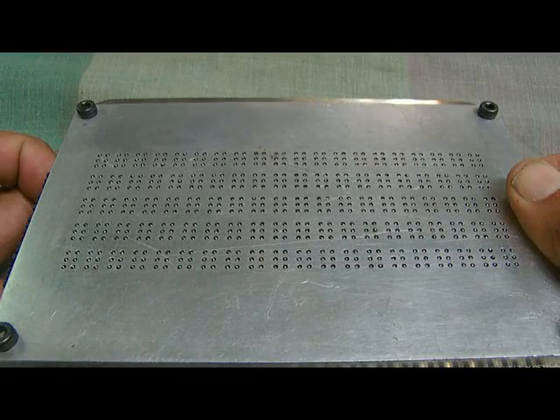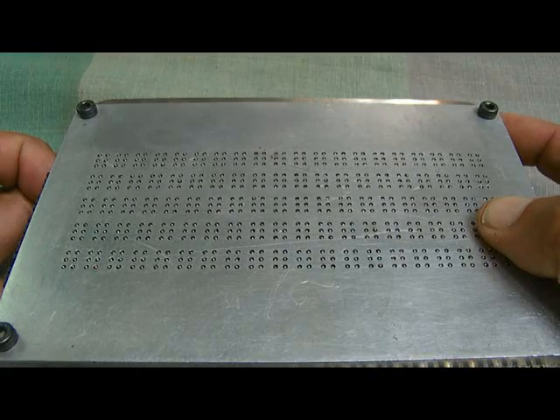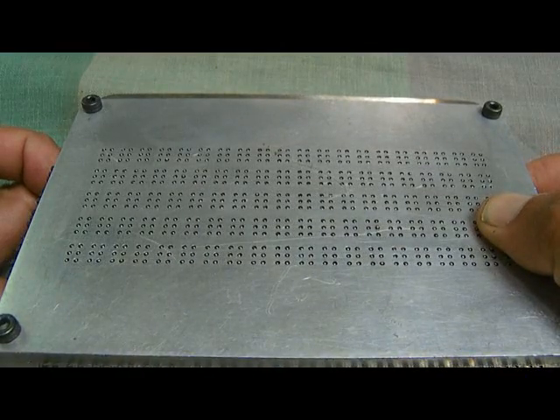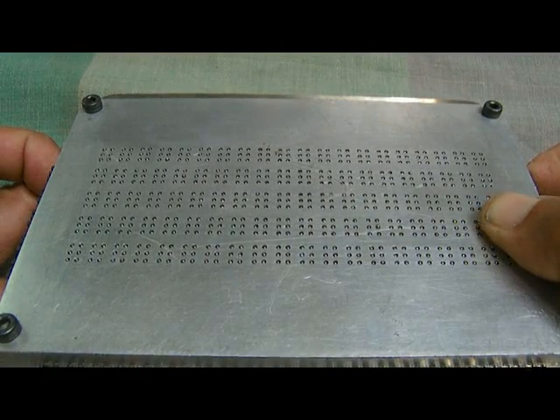In this video, I'm going to show you the completed display. Actually demonstrate to you how the pins actually jump up and down. I've removed the cams because those are not necessary. Cams restrict the movement to actuation to one column at a time, so I've removed them.